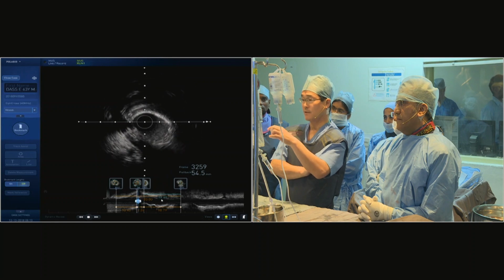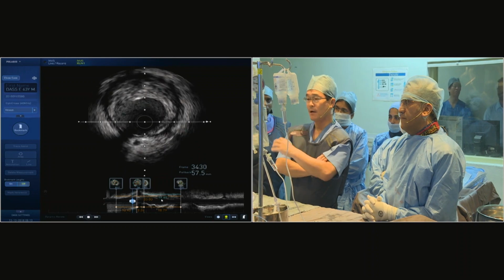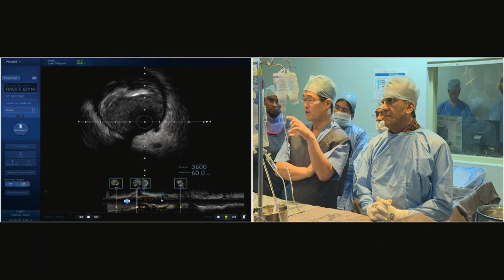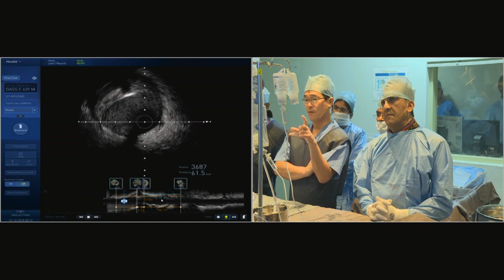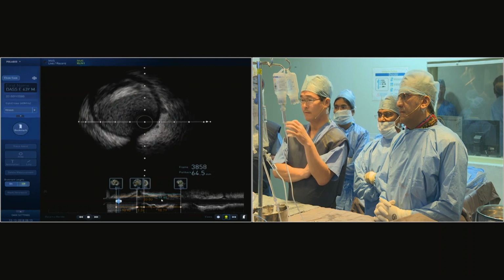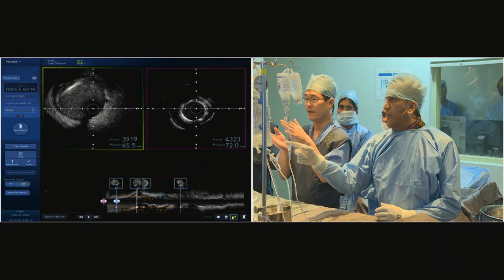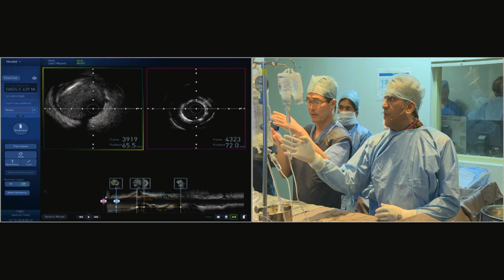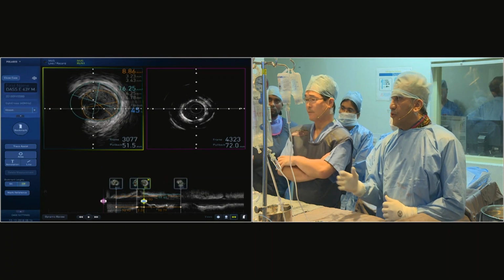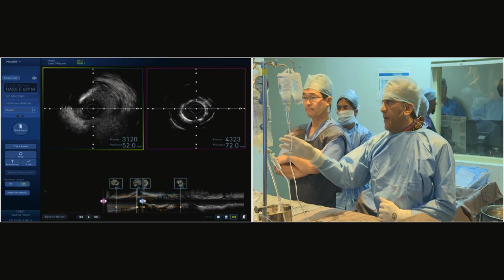And plaque is extending just proximal of the region and into the distal left main. So I think it may be difficult to put a short stent only in the proximal LAD for this region. So my idea is to put a stent from left main to LAD, probably a longer stent, or put a short stent from left main to proximal LAD and another stent for the more distal part. The diameter of the left main is very large. Would you like to prepare this lesion with a cutting balloon?